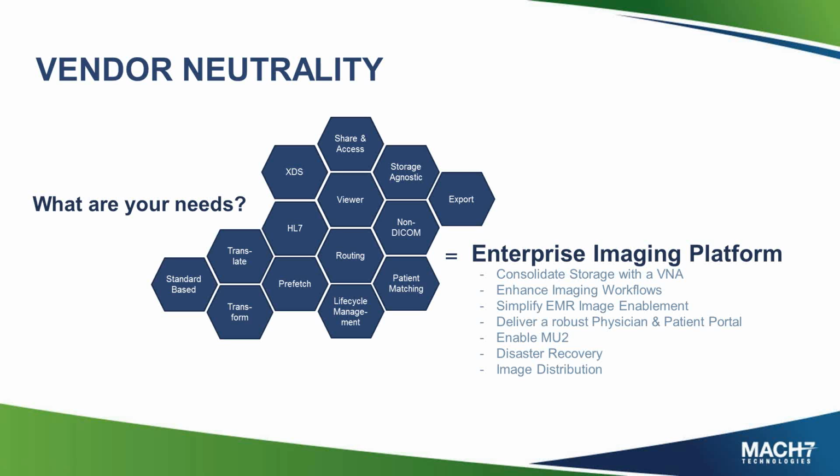XDS is certainly seeing more adoption outside of the United States, but as we're seeing, HIEs primarily driven from the States start to build some momentum in some cases. How do we leverage XDS the right way? And when XDS does become a part of our state or our region or our HIE that we're looking to connect to, will your vendor-neutral archive support that? And if it does support it, does it require you to have to do a migration to a secondary module add-on to that VNA? Do they have a secondary repository, XDS repository or XDS registry that you have to purchase? And if it does, what is the migration effort to get into that? Or does it all just natively support it? For instance, if I receive a DICOM image file, I can later have it queried out through XDS consumers. So that's also where I start to see some of the VNA vendors and their strategies and their own products start to differ.